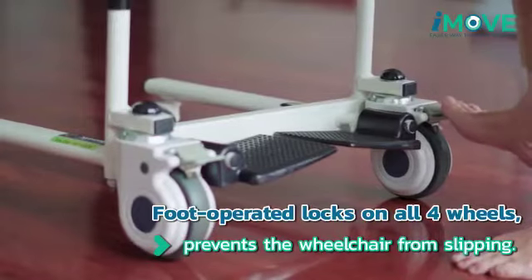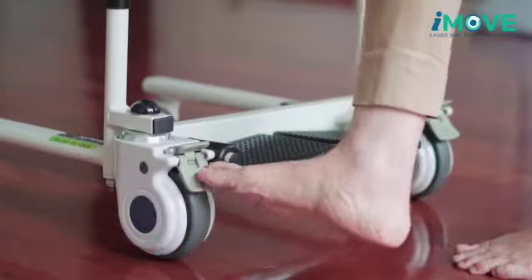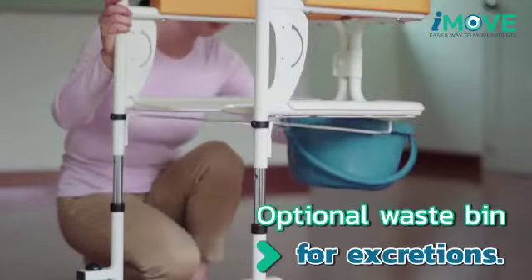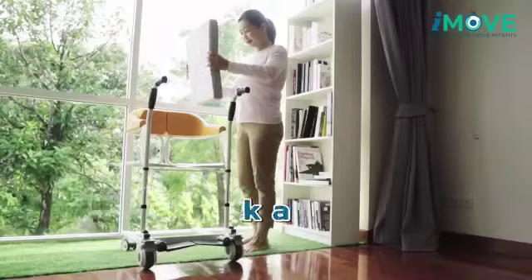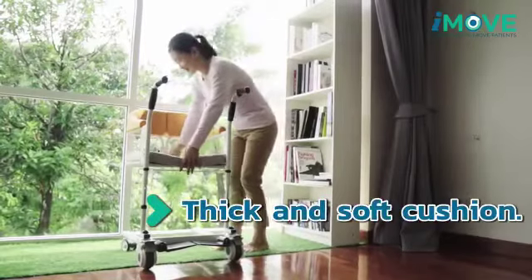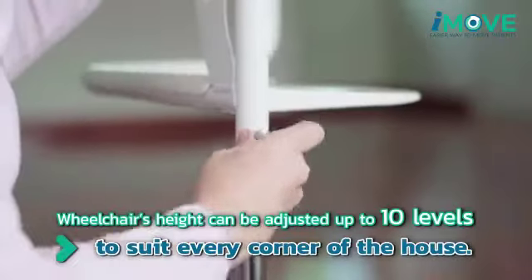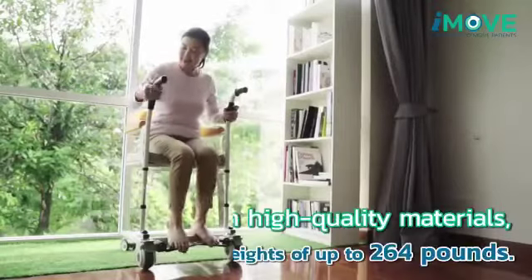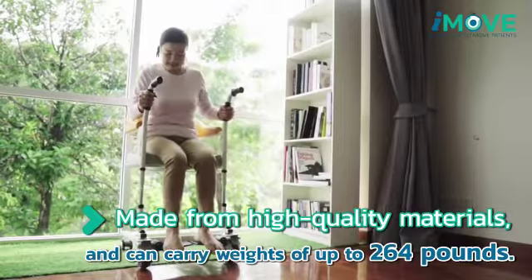You also don't have to worry about the wheelchair slipping as there are foot-operated locks on all four wheels. An optional waste bin can be installed to support the patient's excretion functions. It also has a thick and soft cushion for additional comfort, and the wheelchair's height can be adjusted up to 10 levels. It is very strong and can carry weights of up to 264 pounds.